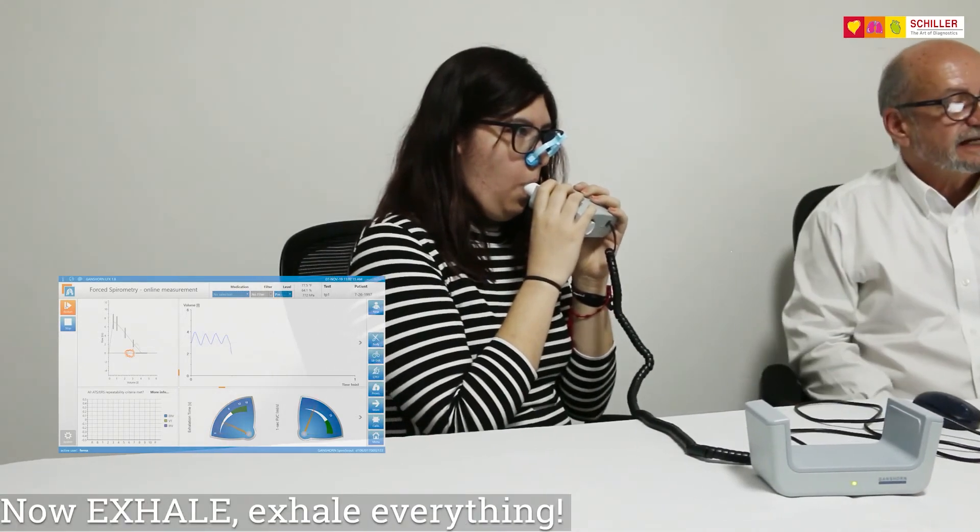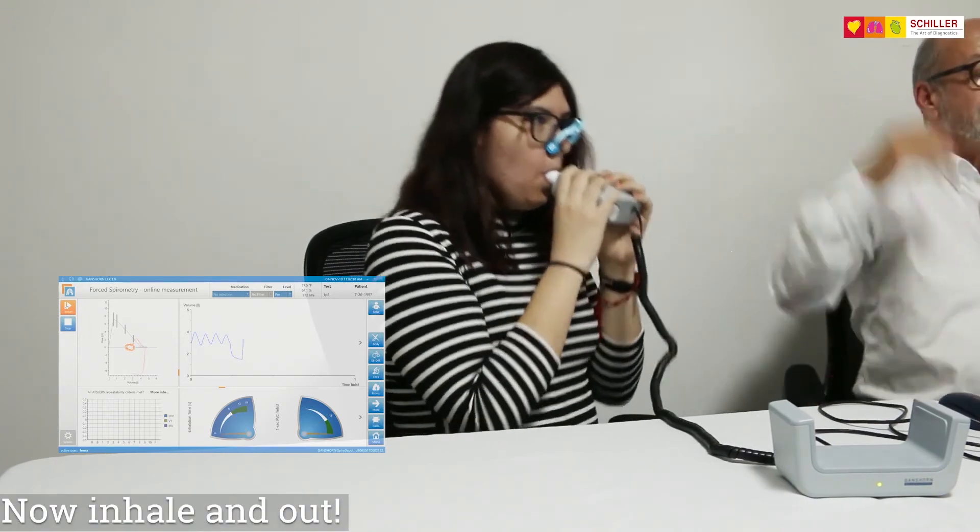Now exhale — exhale everything, more, more, more. Now inhale and out — more, more, more, a little bit more, a little bit more.